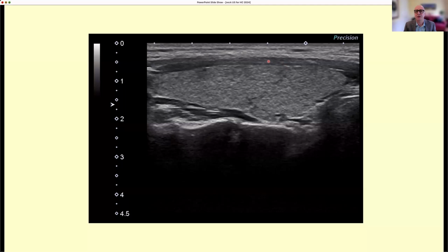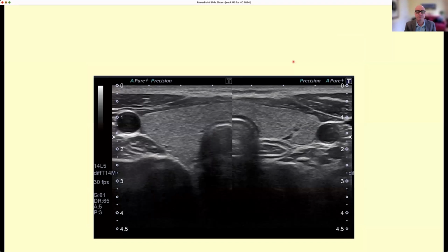For contrast, look at this. This is a strap muscle, very homogeneous. It doesn't have follicles. So the ultrasounds will cross it very completely, and so you will not have a lot of interfaces. All you see is dark, and that's because not many ultrasounds are reflected back.